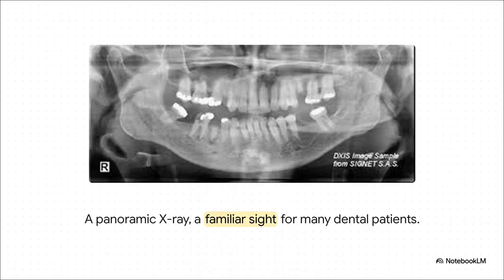Okay, I bet this looks familiar to just about everyone. You know the drill, right? You're in the chair, they drape that super heavy lead vest over you, and you have to bite down on that kind of awkward piece of plastic. It feels so routine now, but what you're looking at is a window into a totally hidden world.